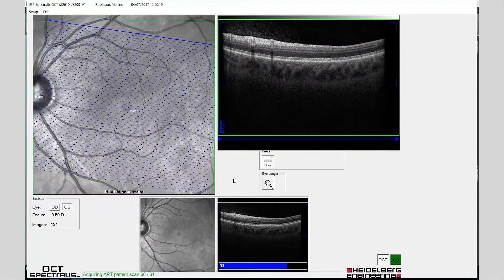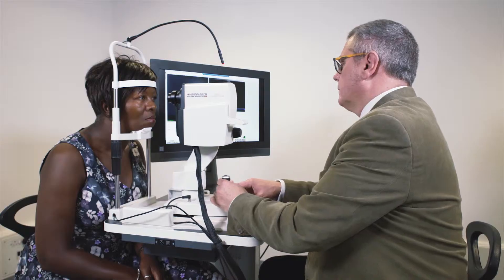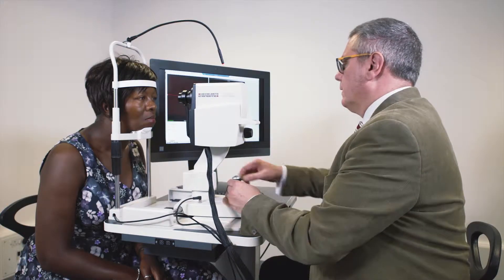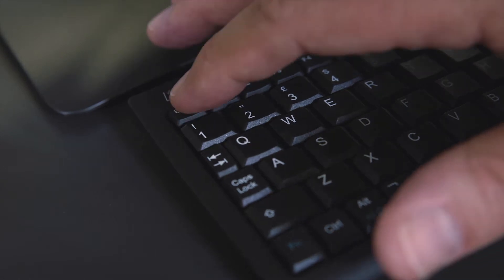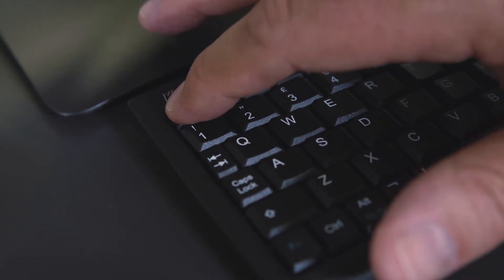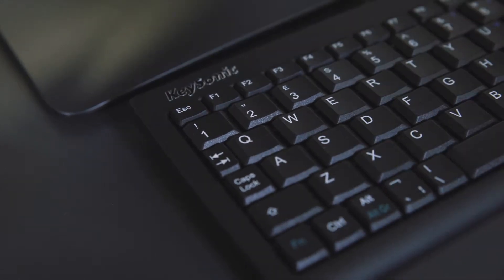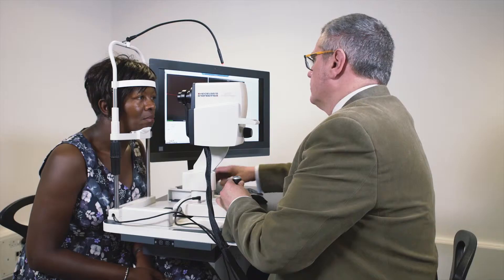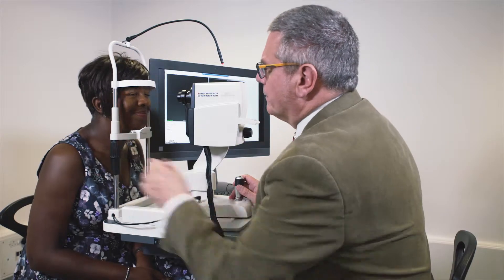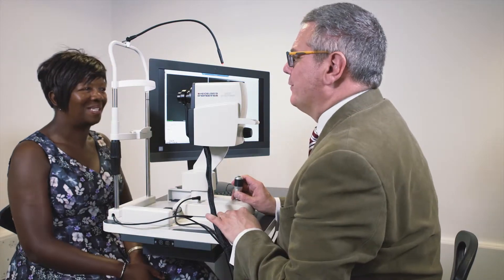Once the scan is complete, press Escape to exit the image acquisition window. The patient should be instructed to relax and sit back from the instrument.